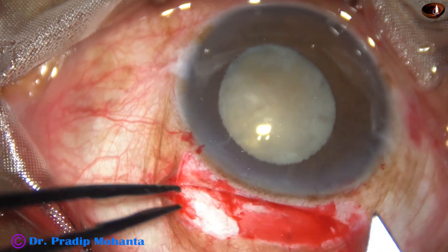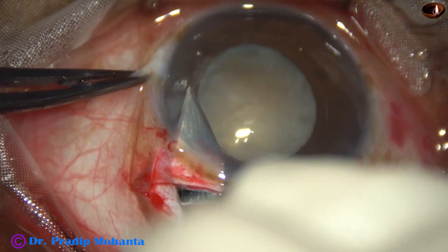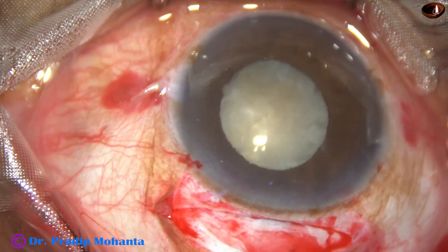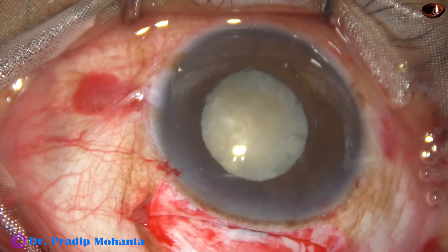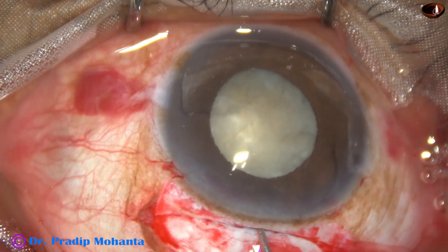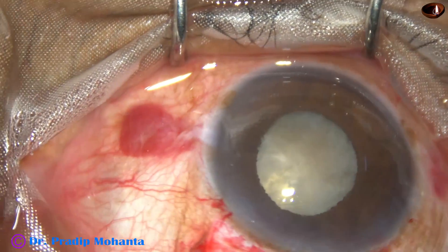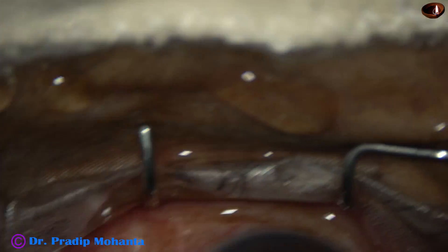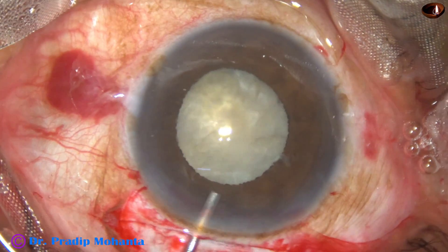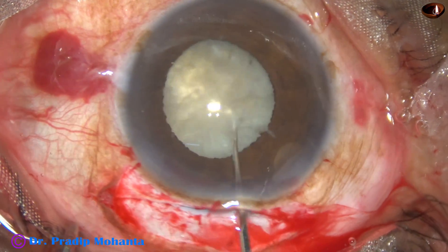I inject some more visco, then take the keratome and open the sclerocorneal tunnel — we should cut as we go forward. Hydrodissection is not much necessary here; just a little bit, because excessive hydrodissection and fluid pressure can cause extension of the rhexis posteriorly. I inject some more visco and now have to prolapse the nucleus from the capsular bag into the anterior chamber.